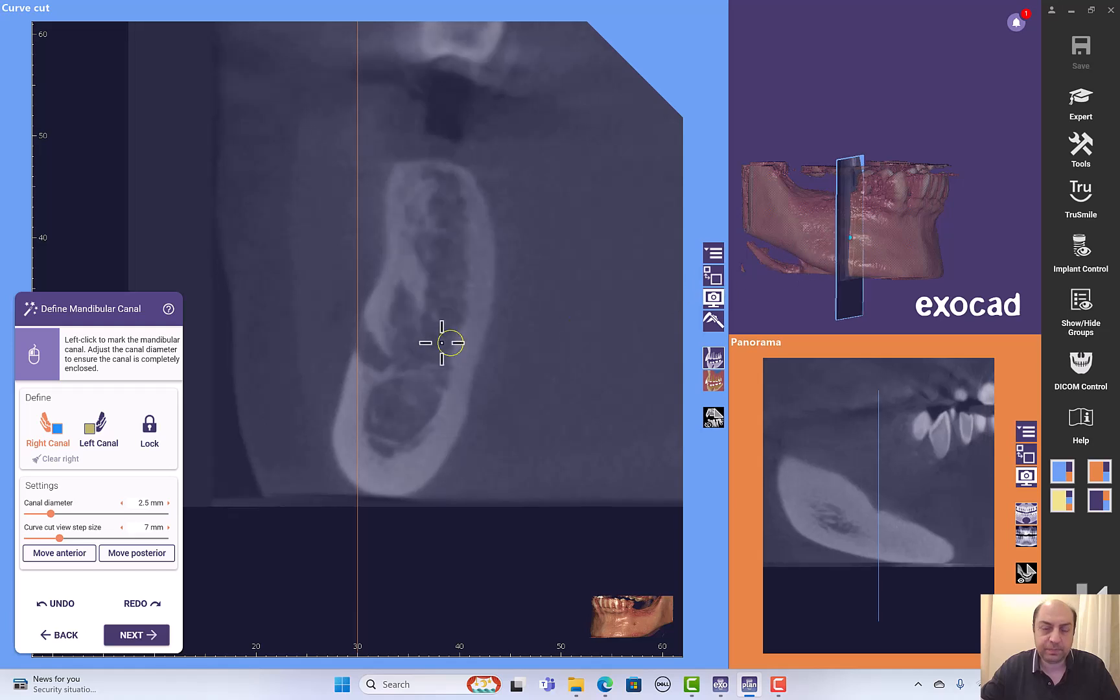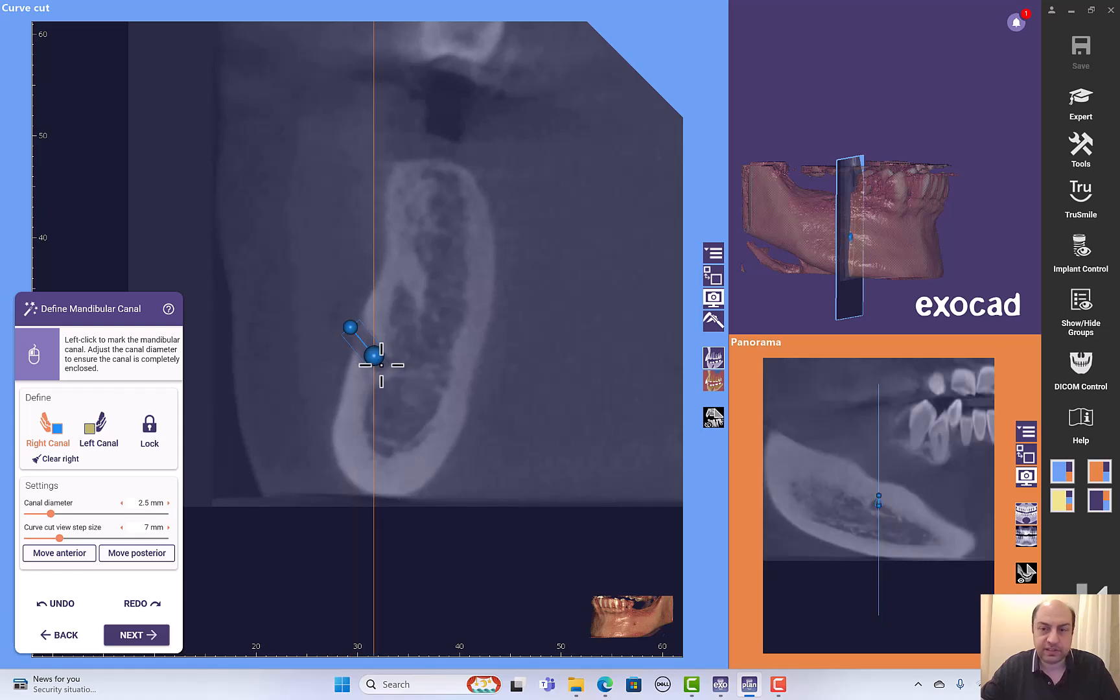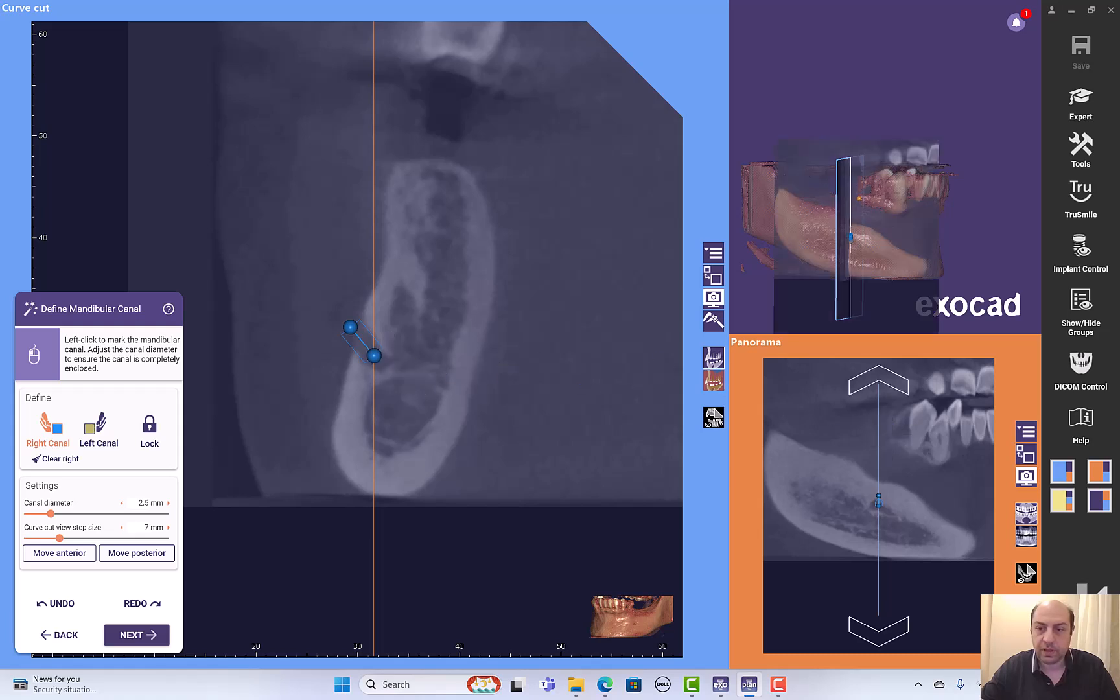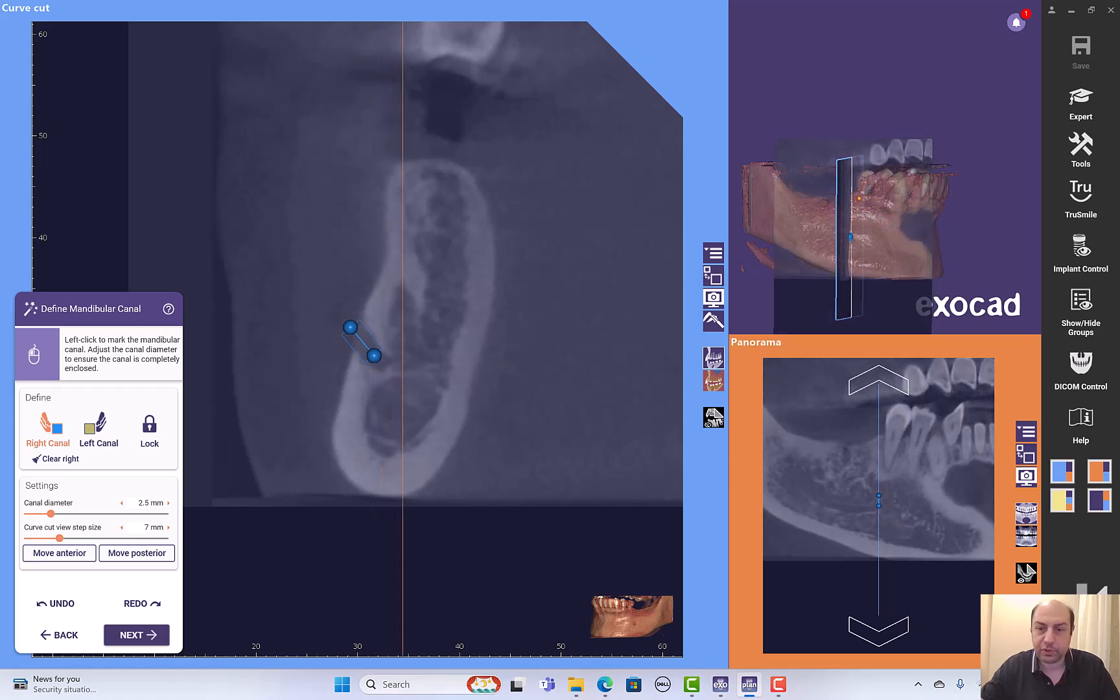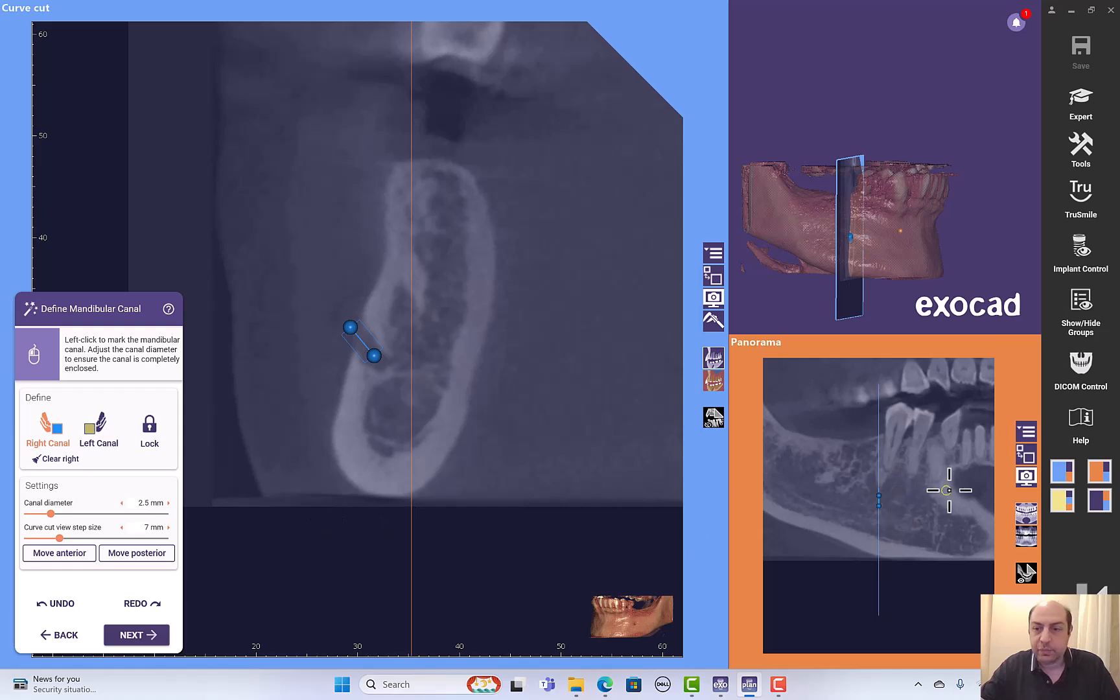I will click on the 3D again. I will start my point, first one outside the mental, second is inside. I can adjust the panoramic curve too and I can move posteriorly and click a dot.